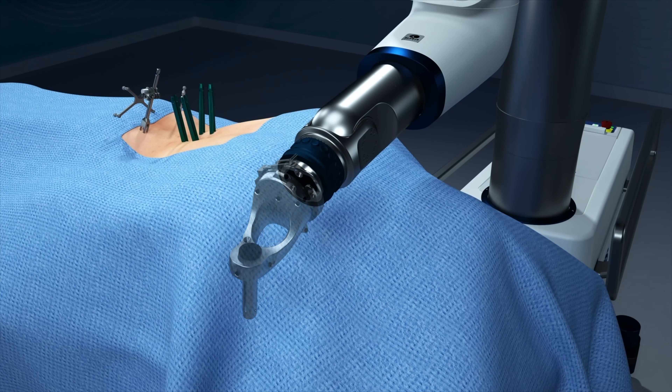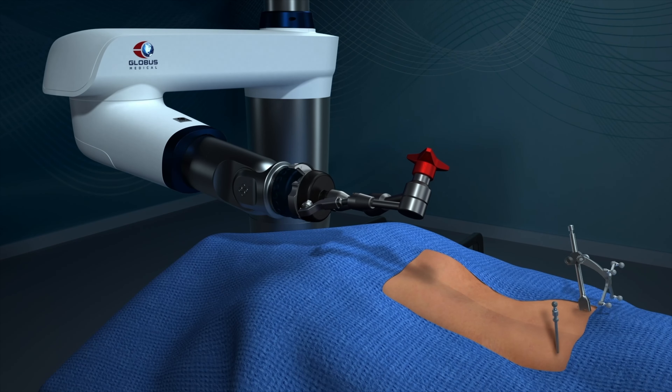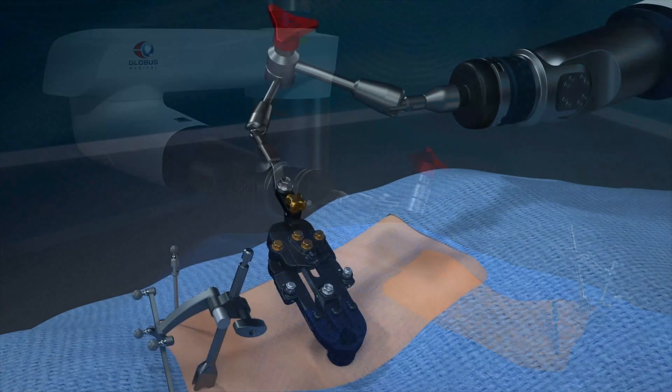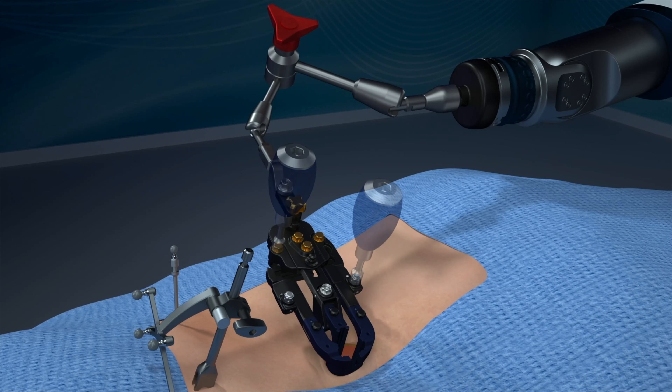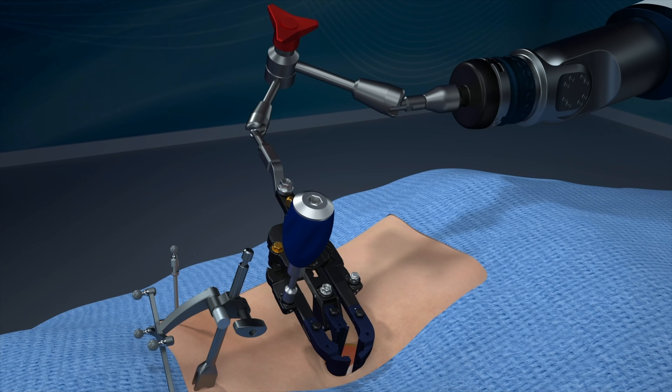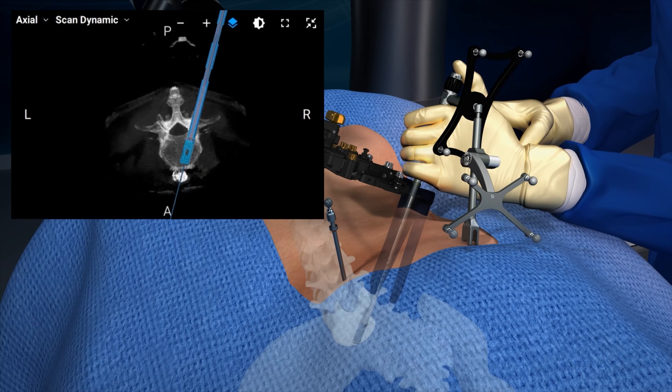For interbody navigation, the active end effector is swapped for a motion lock end effector, which acts as a stable mount for the retractor. When the retractor is expanded, the surgeon can navigate instruments for disc prep, trialing, and interbody insertion, all while viewing live feedback of the instrument's location on the robot's screen.